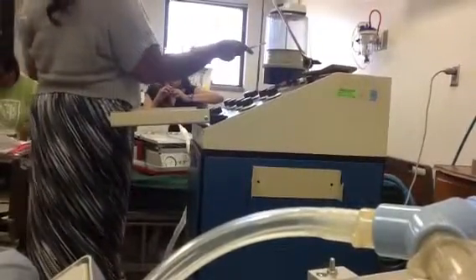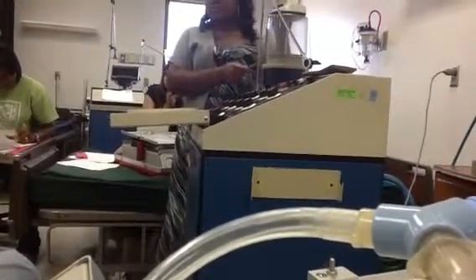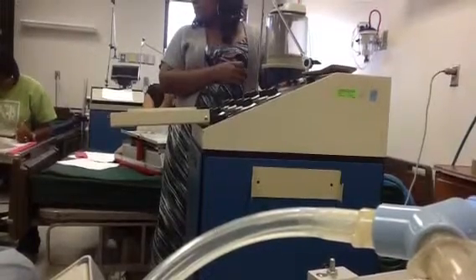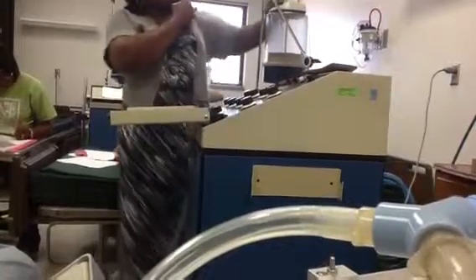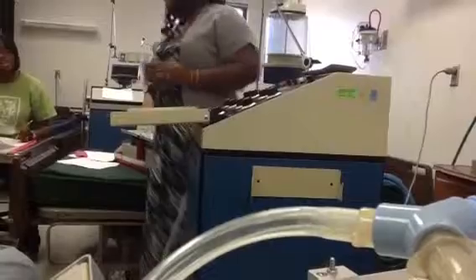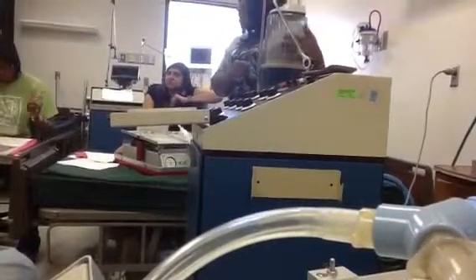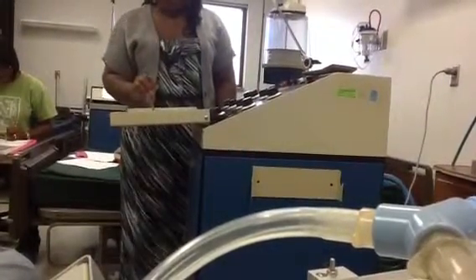100 below. That's the dipstick. Hold up. Okay, so we said it 400, low volume. That's the 400 low volume, but we're charting in liters, which is point 400. Is that in milliliters? This is milliliters, but remember it's charting in liters. Would we even do it on this 500 too? I guess not, no.